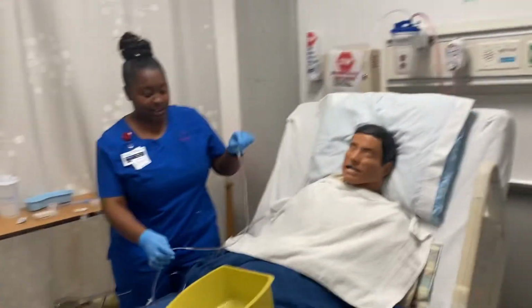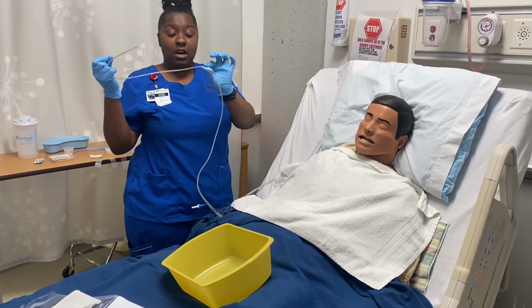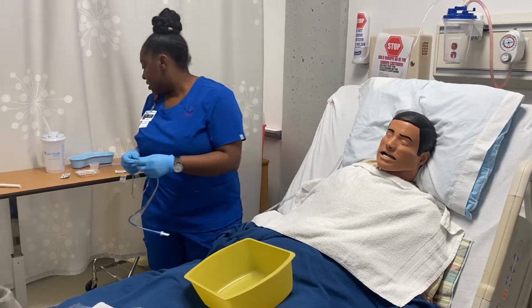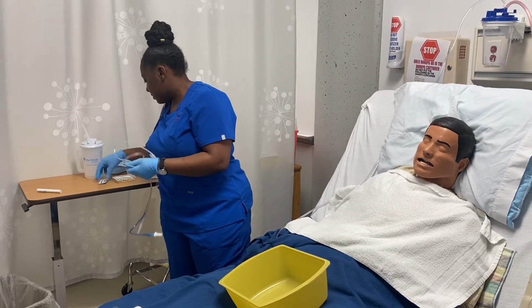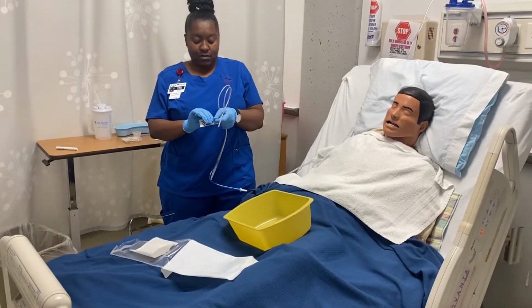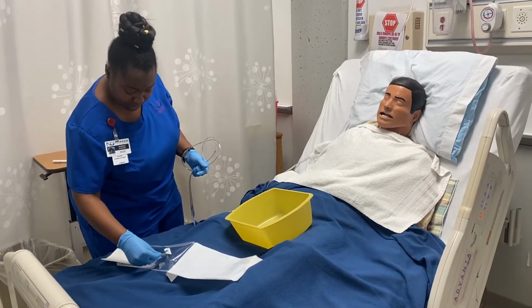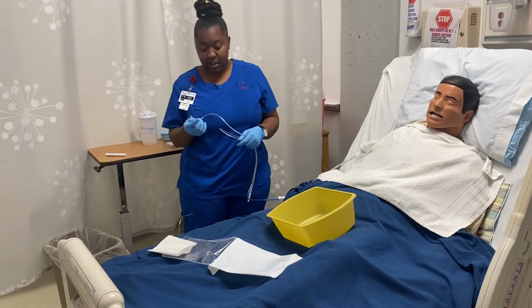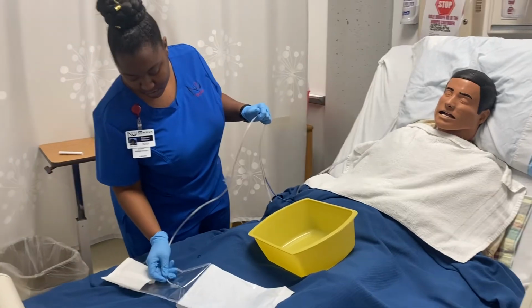Go ahead. So after I mark this, it's about 55. I want to make sure I keep in mind that I'm looking at it, so when I'm putting it down the patient's throat, that I stop at that marking. So now I'm going to kind of wrap it around to give it a little give. And I'm going to take the loop. And then I'm going to put this on. Trash. And I make sure that there's lube on this so it's easy to go down the patient's throat.